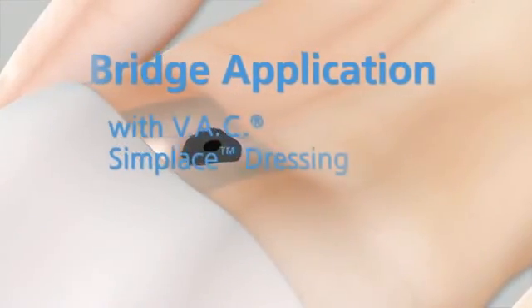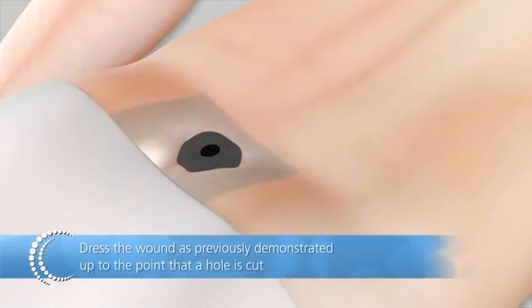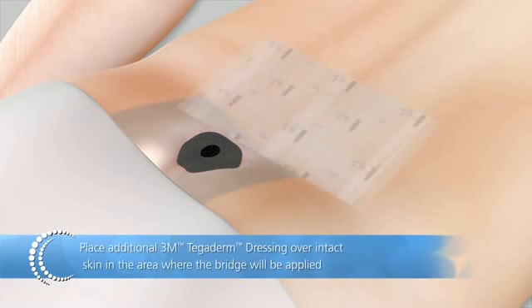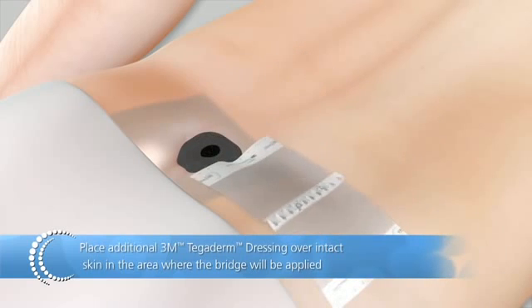Bridge application with VAC Simplace dressing. Dress the wound as previously demonstrated up to the point that a hole is cut in the 3M Tegaderm dressing. Place additional 3M Tegaderm dressing over intact skin in the area where the bridge will be applied.